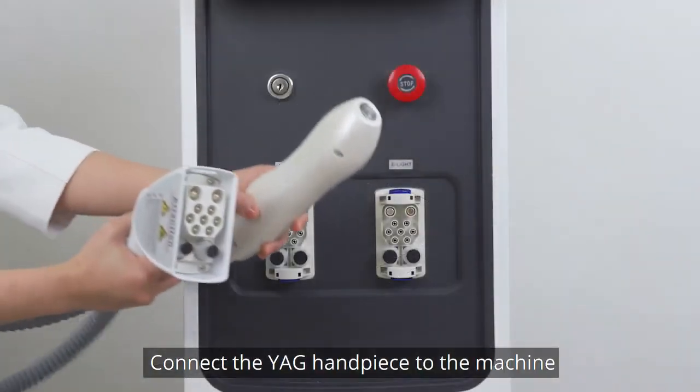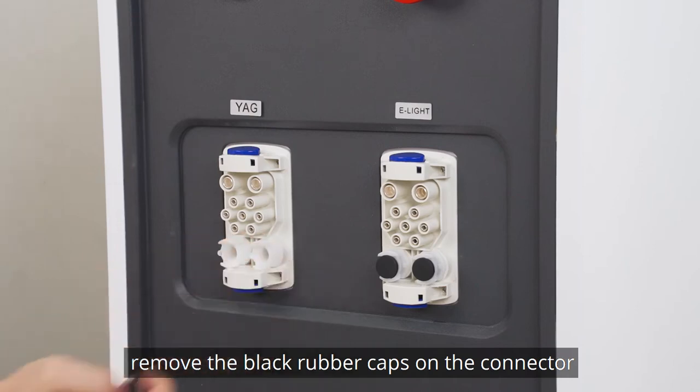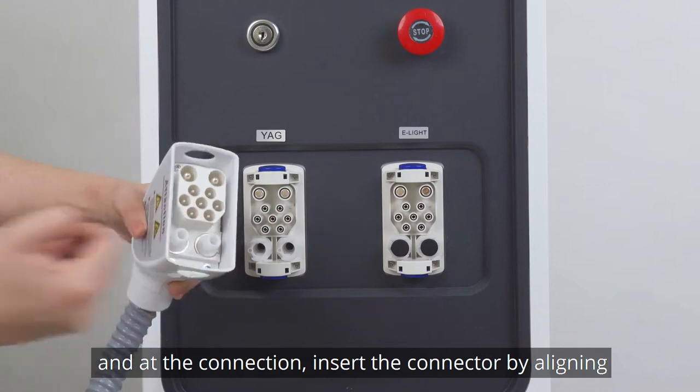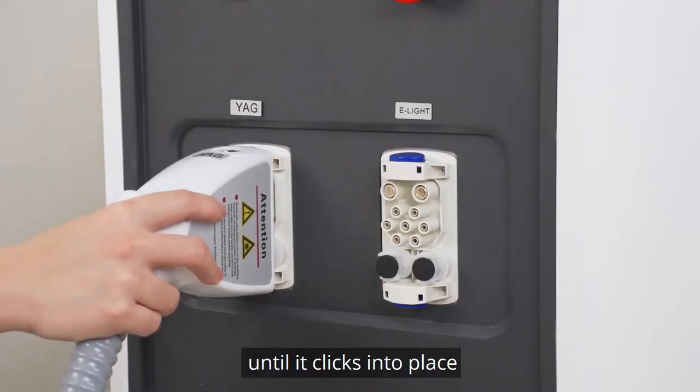Connect the YAG handpiece to the machine. Remove the black rubber caps on the connector and at the connection, insert the connector aligned with the small holes and add the connection until it clicks into place.